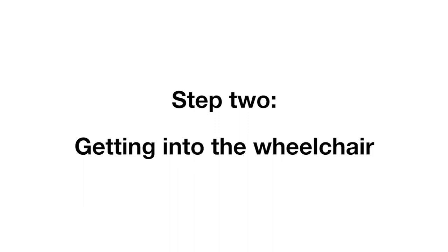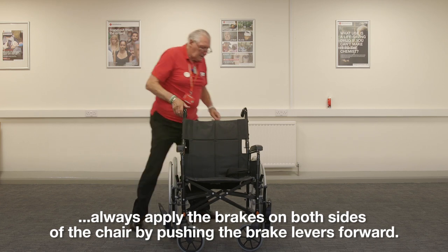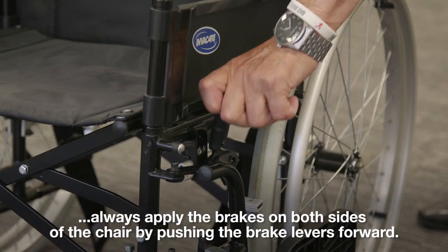Step 2, getting into the wheelchair. Before sitting in the wheelchair, always apply the brakes on both sides of the chair by pushing the brake levers forward.